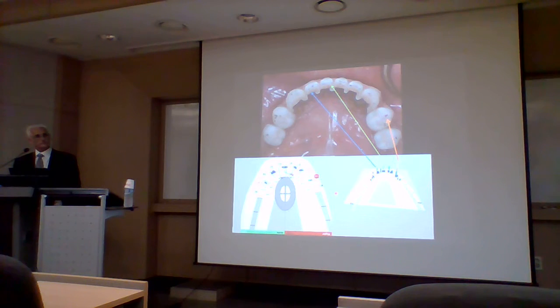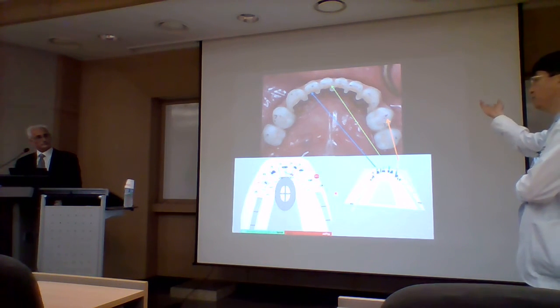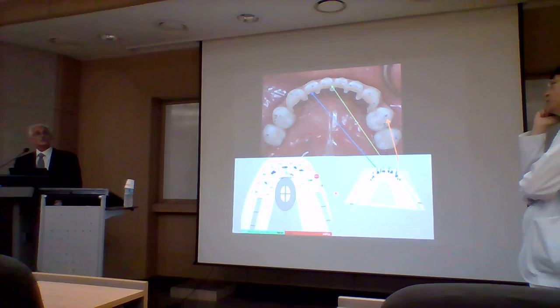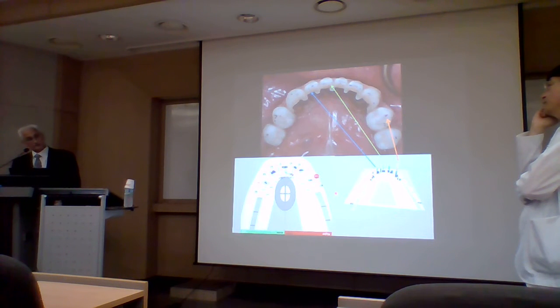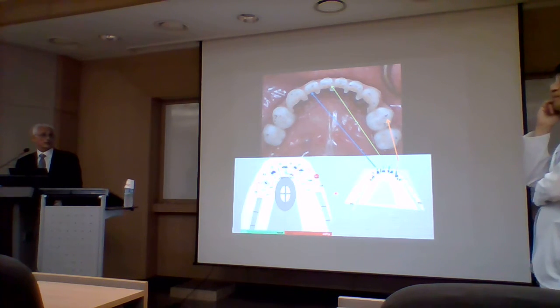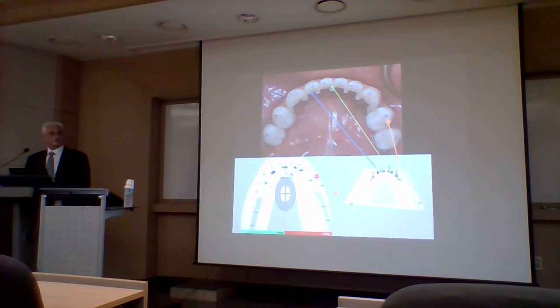Should we, before we measure, mark which one would be the implant, or does the program automatically detect it? That's a good question. When you send up the patient file, you mark the teeth that are implants within the patient file. And then when the forces are too great and it's on an implant, it automatically measures it for you. 들으신 대로 어떤 놈이 임플란트인지 미리 환자 파일에 알려주고 나면 그 양을 비교해가지고 미리 워닝을 줄 수 있다는 거죠.